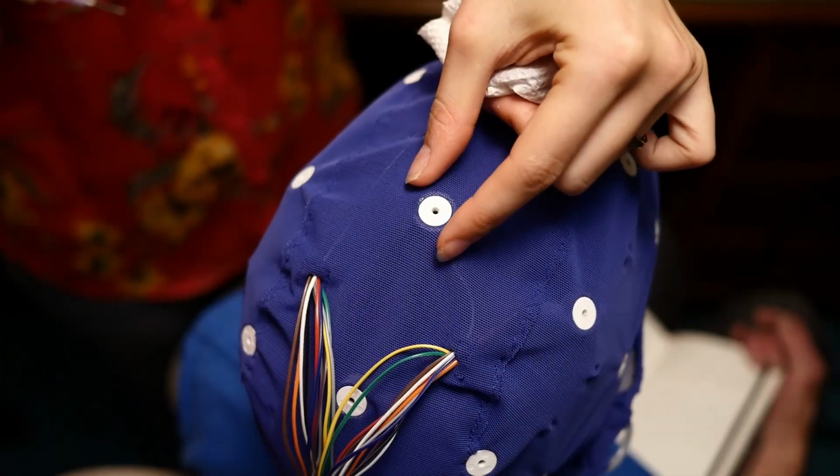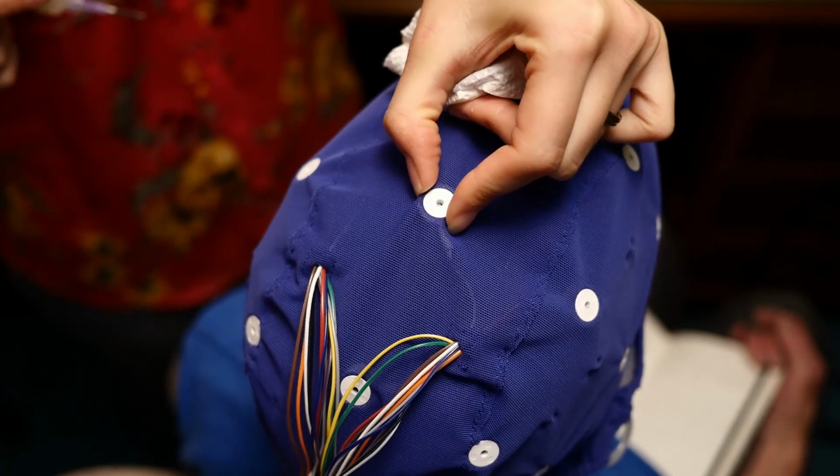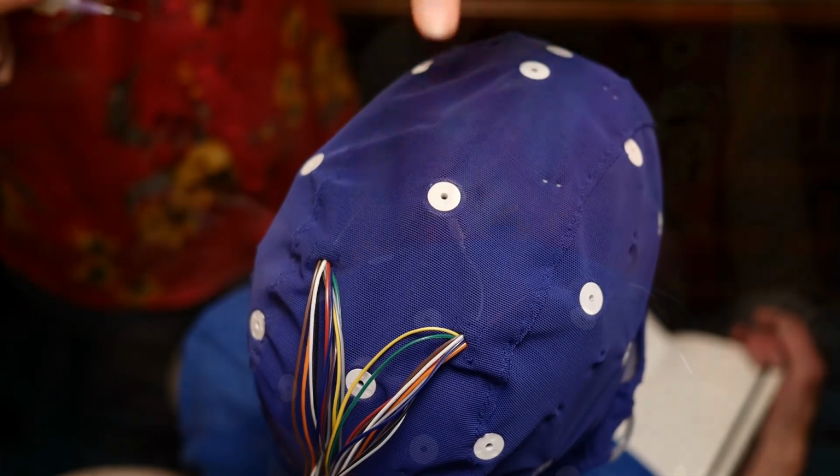So let's talk about the 3 core tenets of improving your impedance with movement. And what I'm talking about is the twist, the tap, and the circle. So we start by grabbing our electrode firmly in hand, and we are going to twist our electrode. This is going to allow any air that is still in the electrode to rise to the surface and escape.